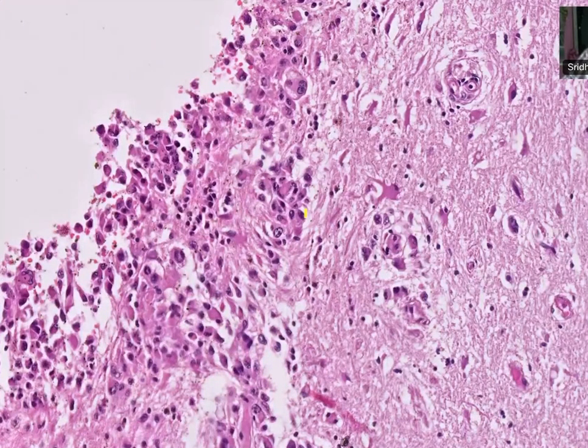You can see some cells scattered, infiltrating here, but you can still make out a line you can draw. They may not usually be called circumscribed, but it's high grade, and the interface is distinct here. So based on histology, we may not really call it a diffuse type, but it has a cellular tumor, high grade morphology.